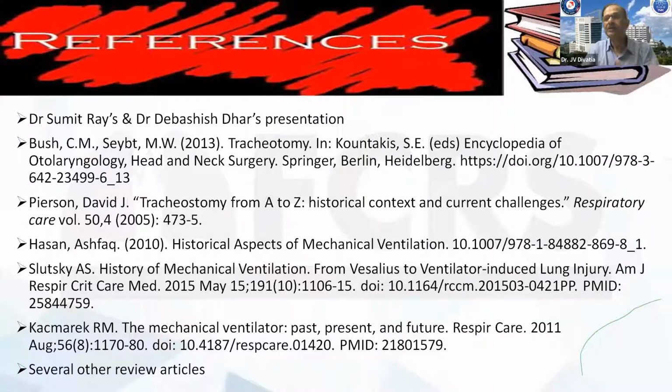And now the focus is shifting, apart from modes which improve patient comfort and synchrony, to how we minimize, prevent or reduce ventilator-induced lung injury. So all your low tidal volume ventilation, your ultra protective lung ventilation. I think we covered that shift in thinking extremely well.